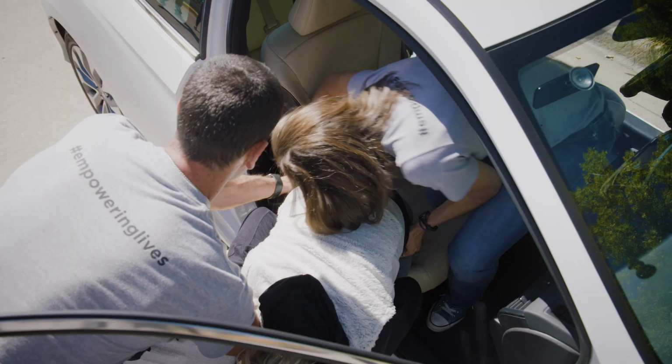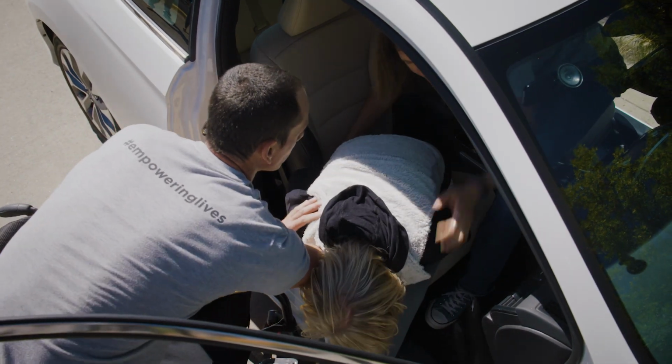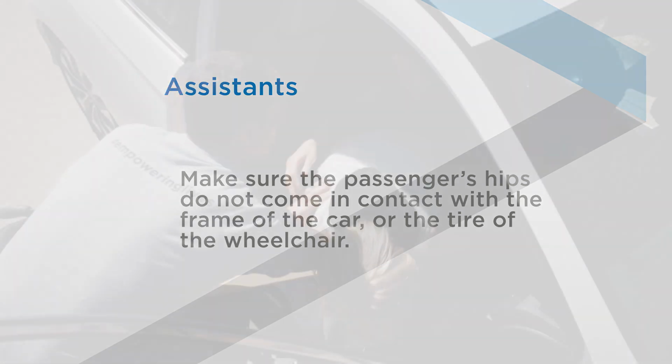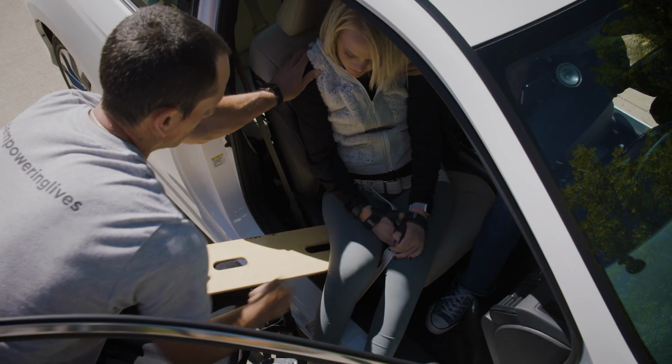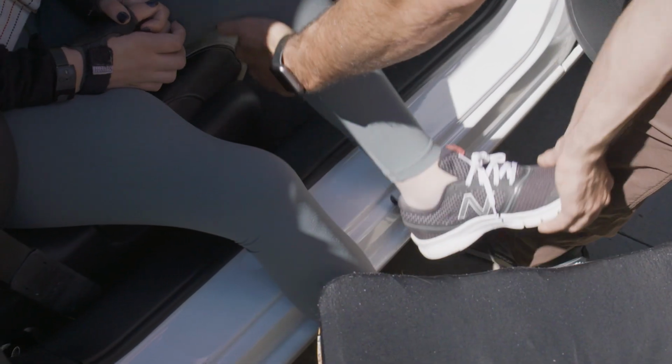Make sure the passenger's head stays out of the car until the hips are safely on the car seat. Both assistants should make sure that the passenger's hips do not contact the frame of the car or the tire of the wheelchair. Once the transfer is complete, the outside assistant will remove the slide board and then will lift the passenger's feet inside the car.